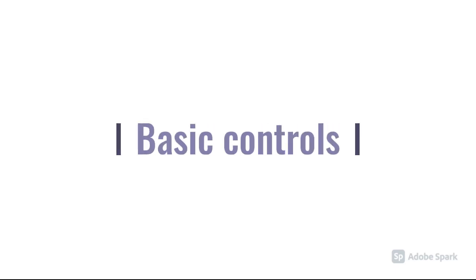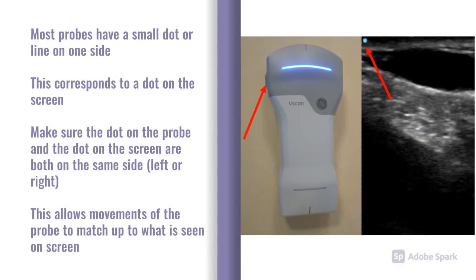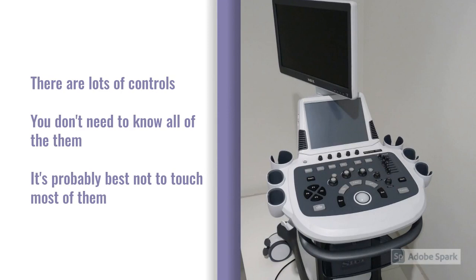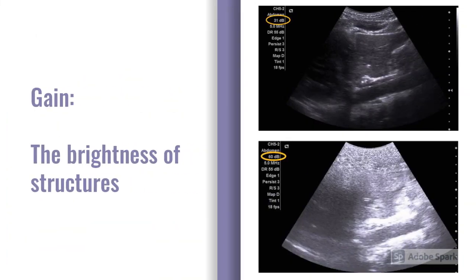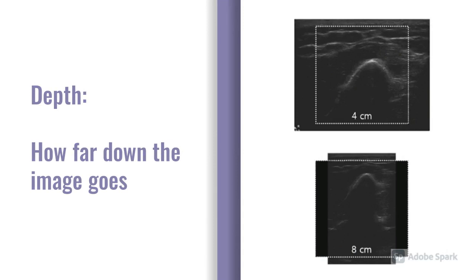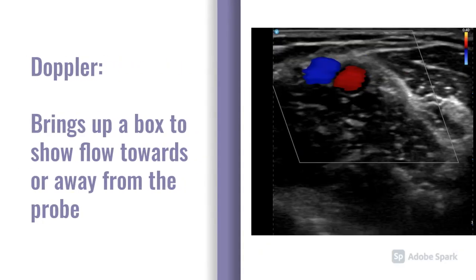Most probes have a small dot or line on one side of the plastic structure, which corresponds to a dot normally on the left side of the screen. This allows you to line up your movements, so lateral movements of the probe occur laterally on the screen. There are lots of buttons on the machine, but only a few you'll need: the gain, which is the brightness of the structures; the depth of the image, i.e. how far down the image goes; and the Doppler button, which brings up a box to show flow through structures — useful for distinguishing veins from arteries.